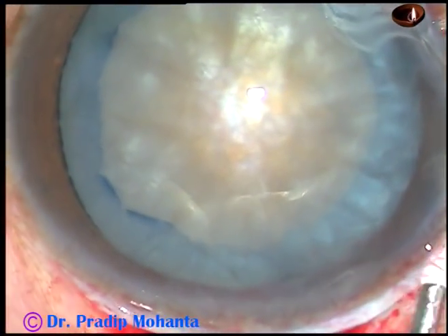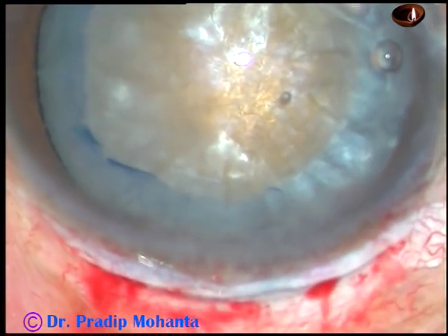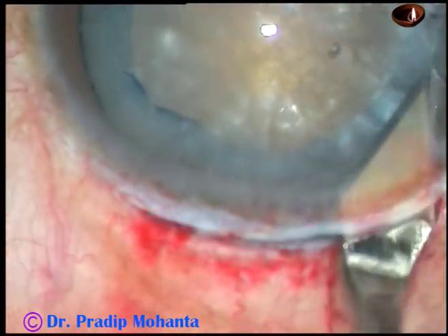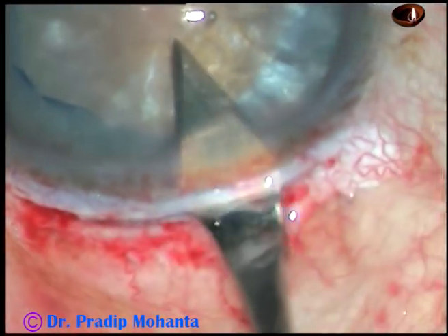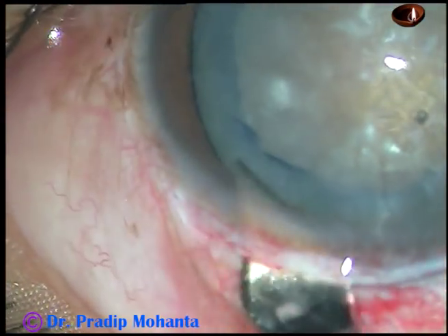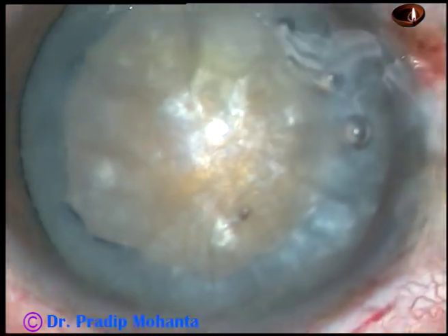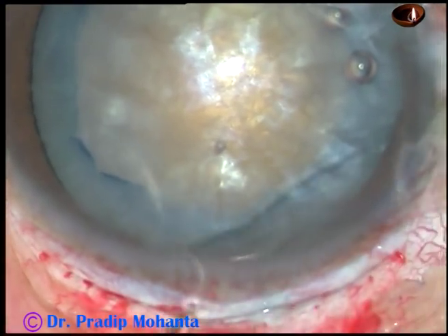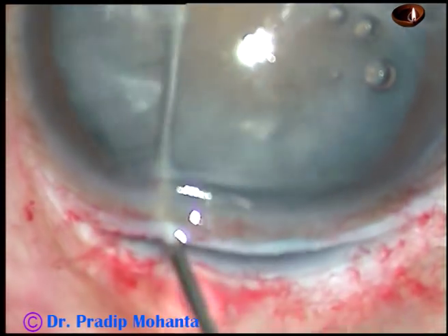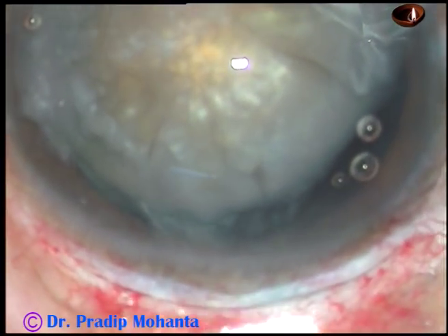Now see how to enlarge the wound. Take a keratome and cut when you go forward — never cut when you come backward towards the sclera. Cut when you go forward into the anterior chamber. Now do hydrodissection. As you inject some fluid, you can see that the nucleus has prolapsed very easily.